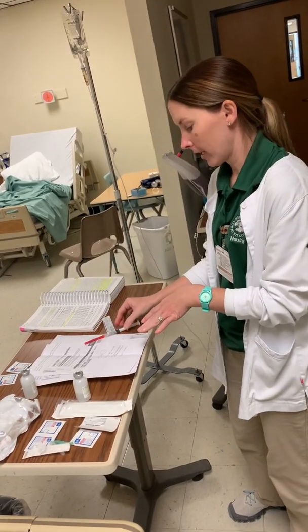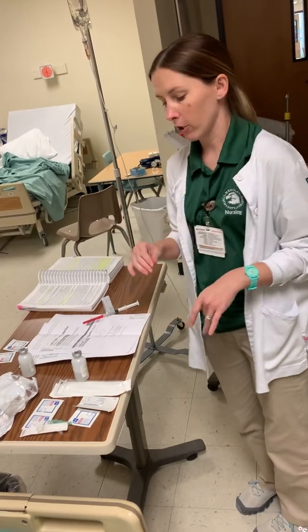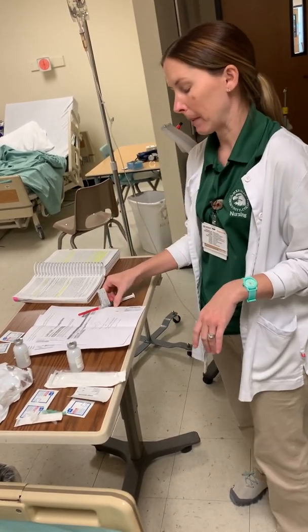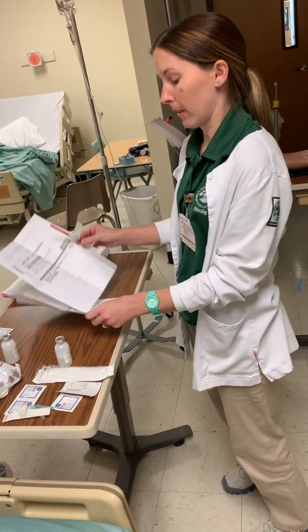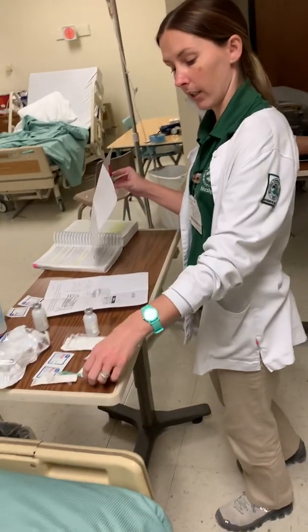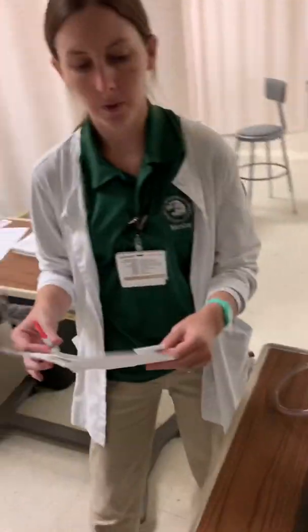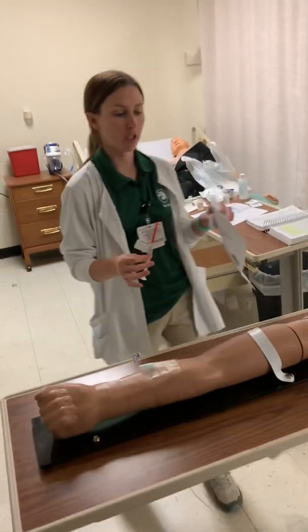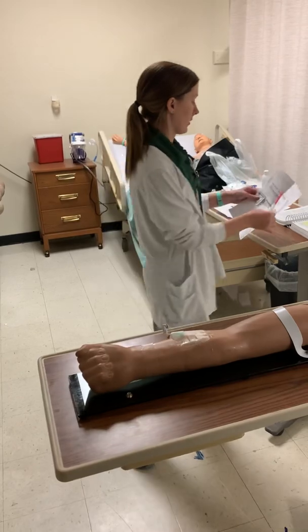Right, and once I have it labeled and I know everything about my drug, I am ready to go to my patient's room. So to my patient's room, I need to take my medication with the label. I need to take my MAR, and I need to take an alcohol pad. So I am going to my patient's room. So in my patient's room, I'm going to identify my patient. So the first thing I'm going to do is identify my patient.